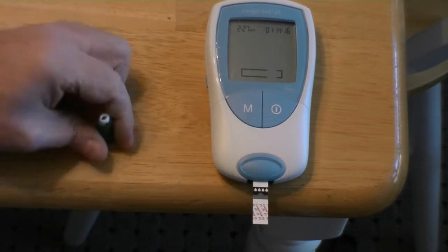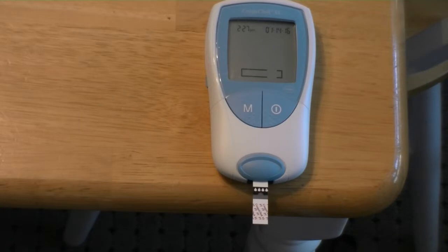We hit the memory button and now we wait for this to count down. It'll beep at us, telling us when it's time to puncture your finger and hopefully draw blood.